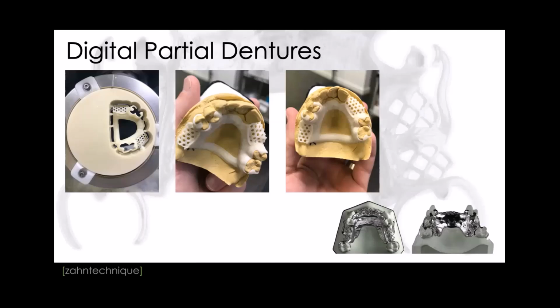And it's also, sorry, I wanted to say something before. I wanted to mention that the metal is also adjustable, especially around the clasp areas, and you all know that at one point or another, you do have to make some adjustments to the clasps and the occlusal rests. So you cannot really do that with the PEEK or the acetyl material.